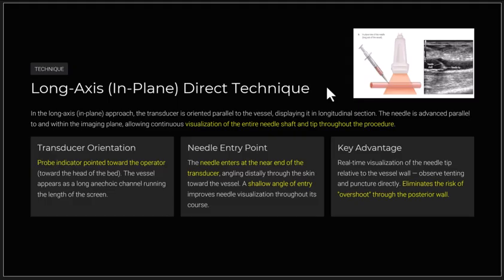But the technique requires you to visualize the entire needle shaft throughout the entire procedure. And you have to be directly under that ultrasound beam. So it does require really good hand-eye needle coordination.